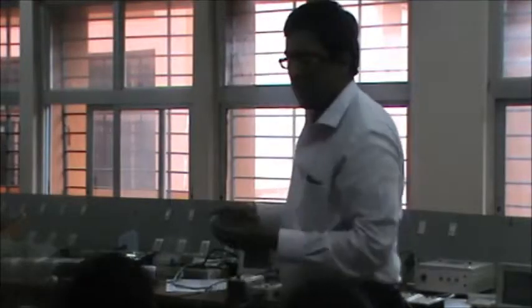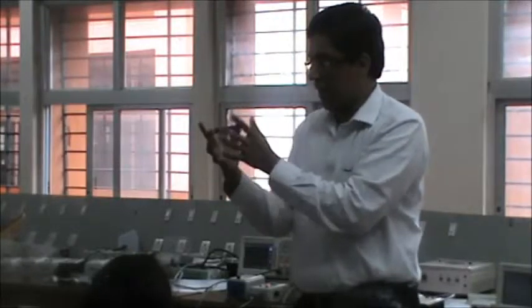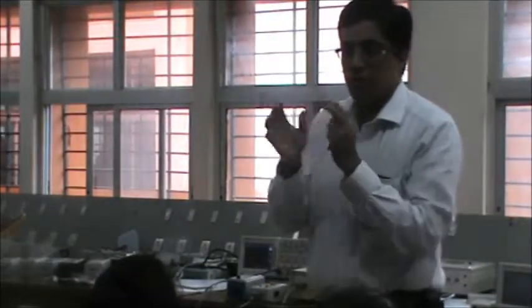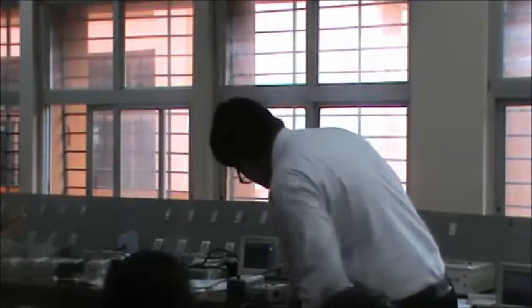ECG is basically a vector quantity. It has both magnitude and direction. So when we are trying to see the ECG from different sides, it will appear differently. Basically, it's just like looking at a pen. We see the pen from this side, it looks different from the side, whereas when I am looking at it end-on, it looks small. Just like that, when we take a projection of this, you are able to see the ECG differently. That is what we are going to see now.